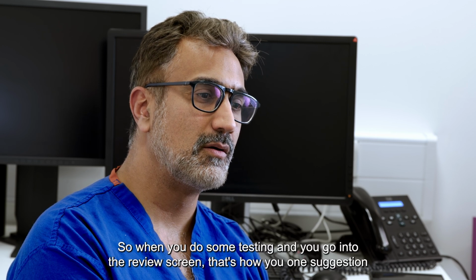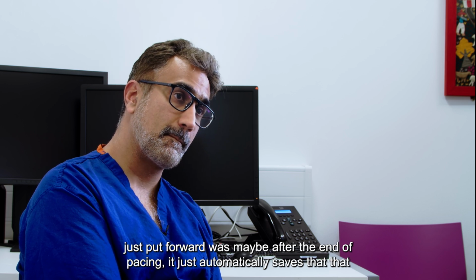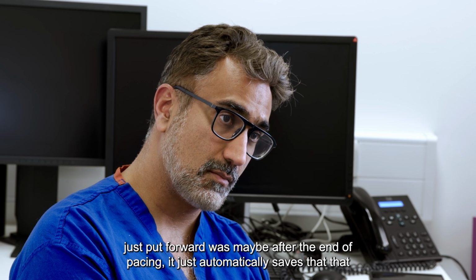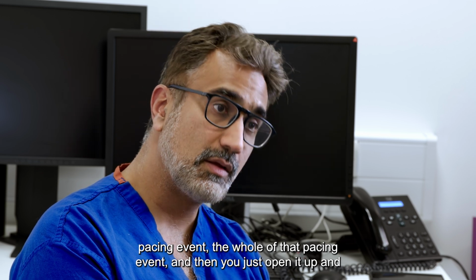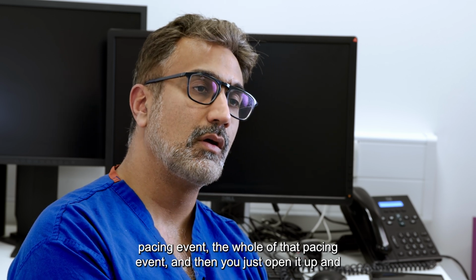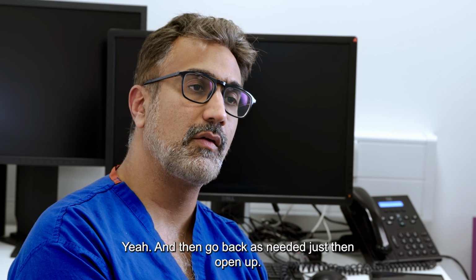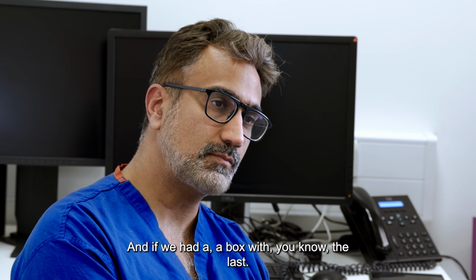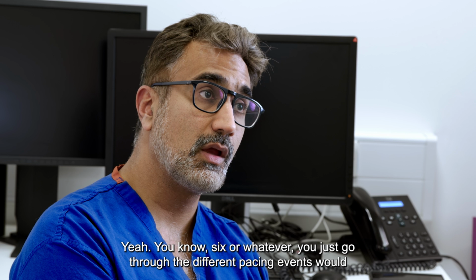Fantastic. So when you do some testing and you go into the review screen, one suggestion I put forward was maybe after the end of pacing, it just automatically saves that pacing event, the whole of that pacing event. And then you just open it up and review that pacing event. Or you could keep doing pacing events, and then go back as needed. If we had a box with the last 6 or whatever, you just go through the different pacing events. That would work.